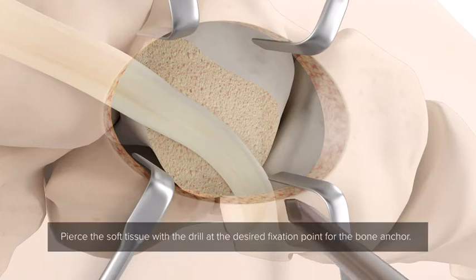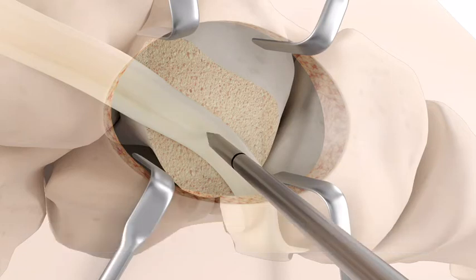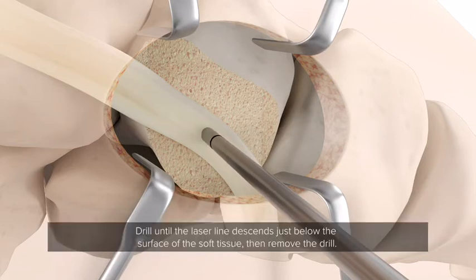Pierce the soft tissue with the drill at the desired fixation point for the bone anchor. Drill until the laser line descends just below the surface of the soft tissue, then remove the drill.